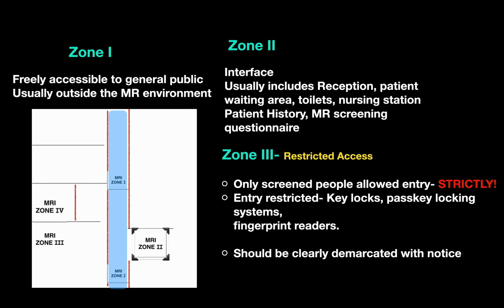So here we have the MRI area in our institute. Here we can see zone 1, which is given in the blue line. It is freely accessible to the general public, usually outside the MRI environment.